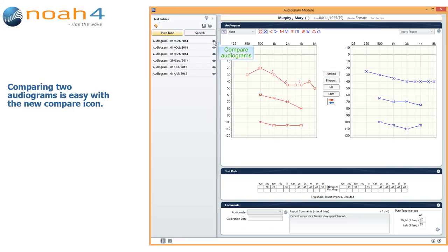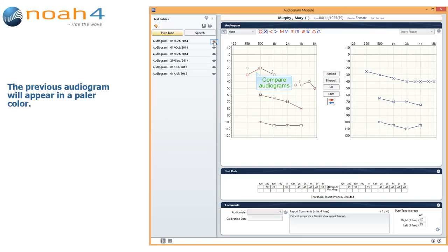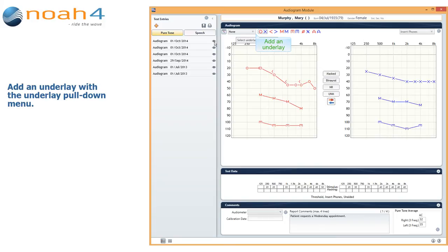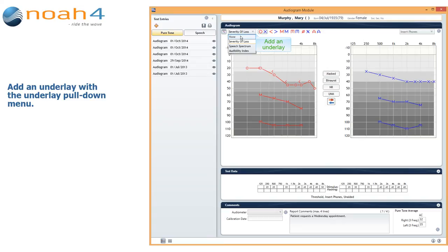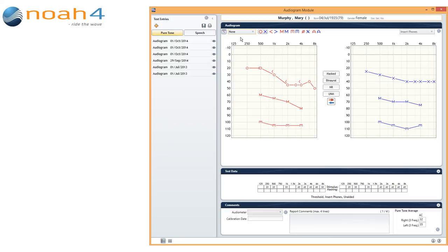Comparing audiograms is easy with the new Compare icon. The previous audiogram will appear in a paler colour. You can add an underlay with the underlay pull down menu, and you can increase the size of the audiogram by hiding other windows.